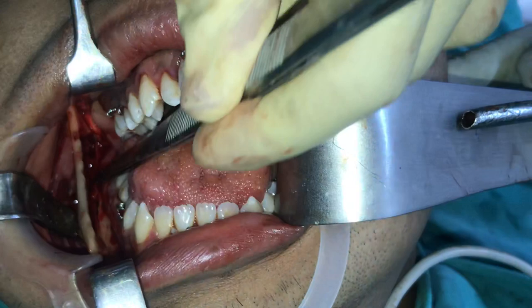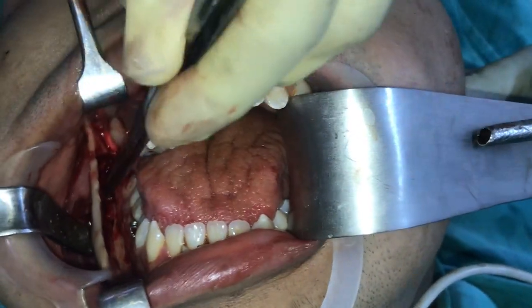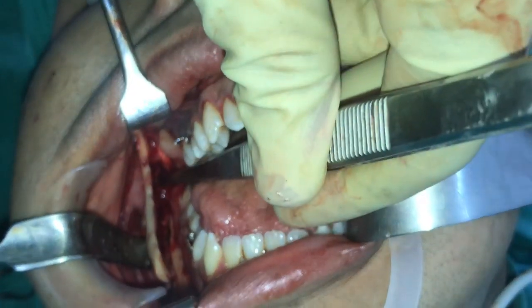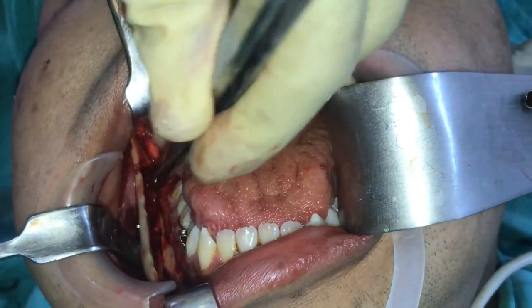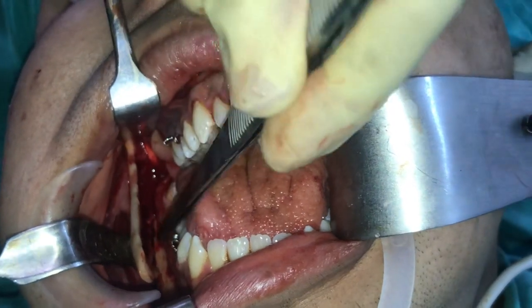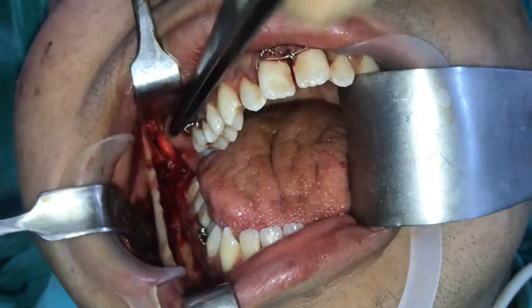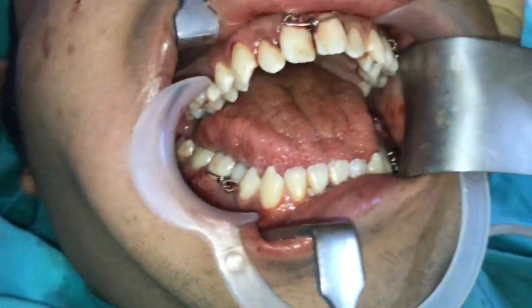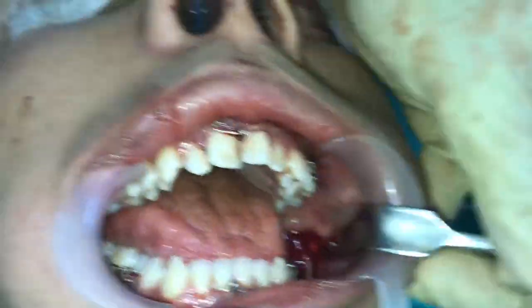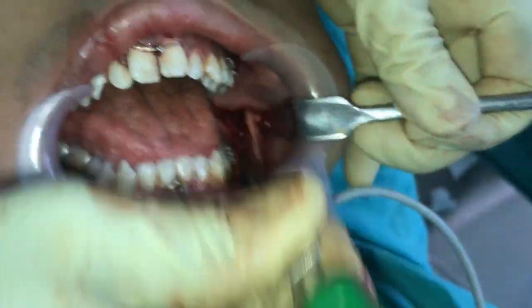You can see there is no nerve there — it's a very long thin cortical plate on one side, and on the other side you have the bone that bears the teeth. The nerve enters and directly goes to this part of the bone, so you have no issues with the nerve. Similarly on this side you can appreciate the sagittal split.